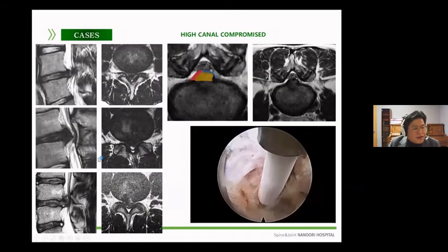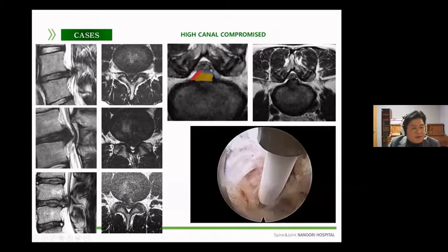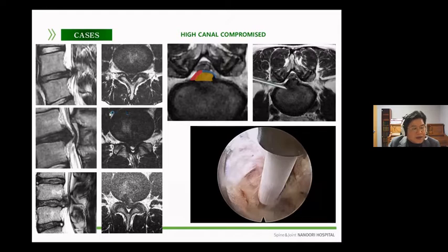In cases of high canal compromise, you can see the high canal compromise here. In these cases, structural retraction is inevitable in open surgery, so neurological damage will inevitably follow. However, a transforaminal approach, if possible, can minimize such neurological damage and maximize the recovery of nerve damage without additional structural damage, as you can see here.